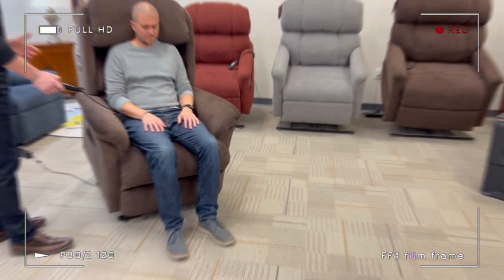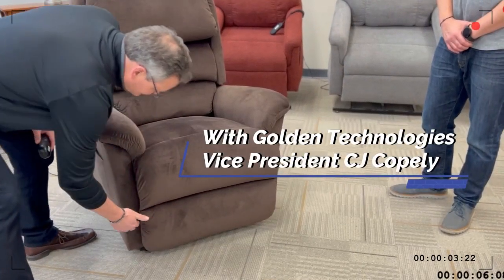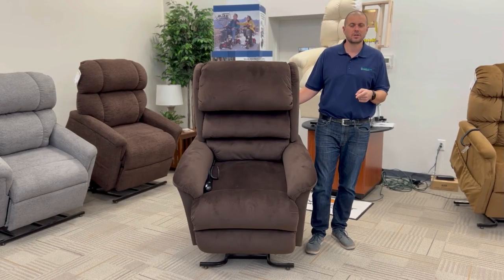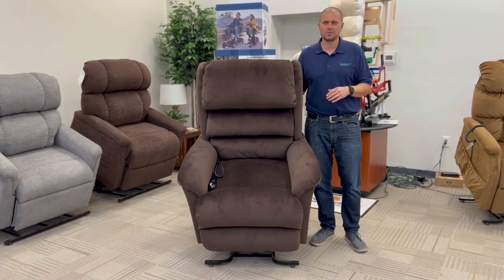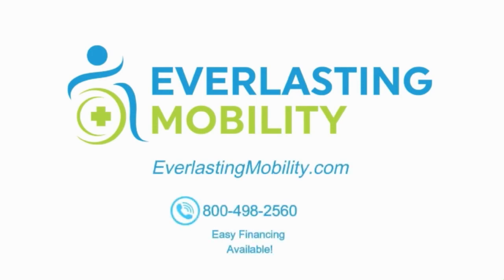In conclusion, if you're looking for a really comfortable lift chair that is capable of zero gravity positioning and is a maxi comfort model, this is an awesome lift chair. We really like this chair and love working with Golden Technologies — they're one of the best brands in the industry. They have one of the best warranties in the industry, which includes one year of in-home service. As long as it's a warranty-approved claim, they will dispatch a technician to your home to diagnose and resolve the issue. If you have any questions, give us a call at 1-800-498-2560 or visit us at everlastingmobility.com. Thank you.